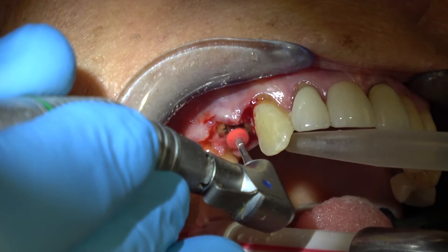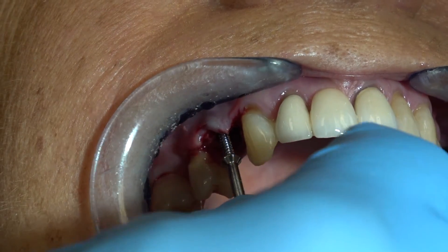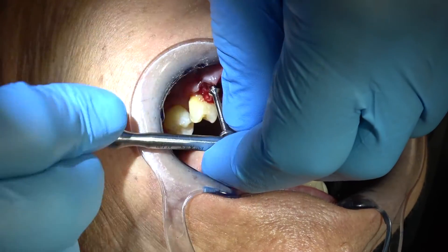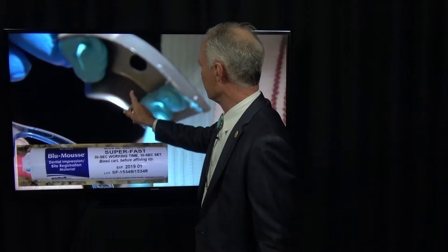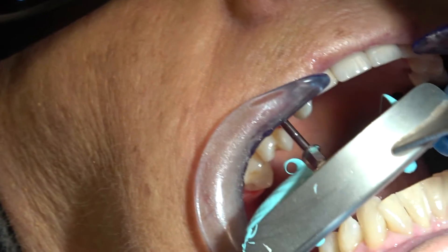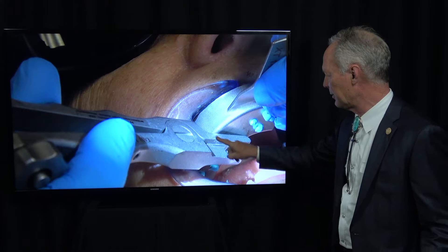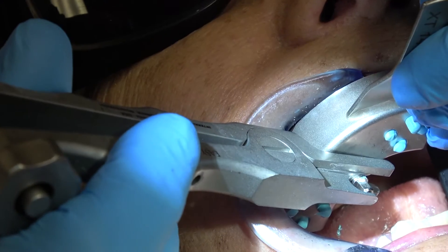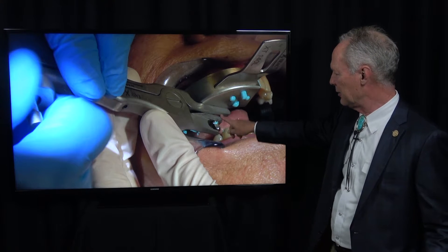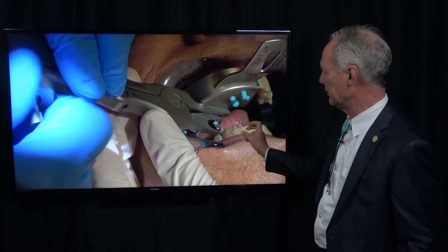There are three drills with the system. This is the second drill. You drill straight into the root canal, and then you screw the extractor post into the hole drilled into the endo canal. This is super fast set blue mousse — you squirt it into the tray. That extraction post goes through a hole, and the blue mousse fits on the teeth adjacent to the extraction site. It's very important that before this sets up, you place the extractor and try it in to the screw, so you want this part to fit just right.